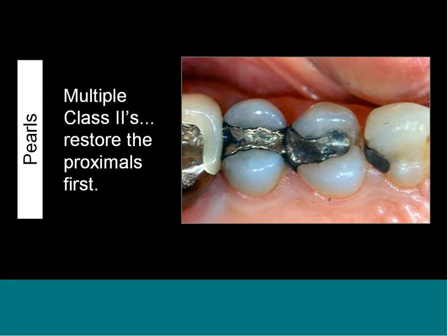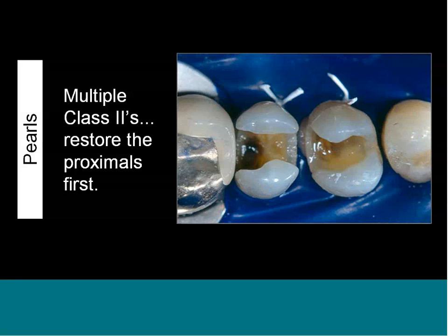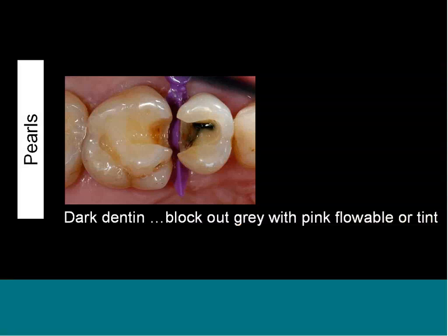Okay. And here's the same thing with severely broken down teeth. These should really be onlays or crowns, with a patient leaving the country for a few months. So we built these up and, I would call them long-term temporaries. And a couple of doctors asked me about this the last hands-on class I did.